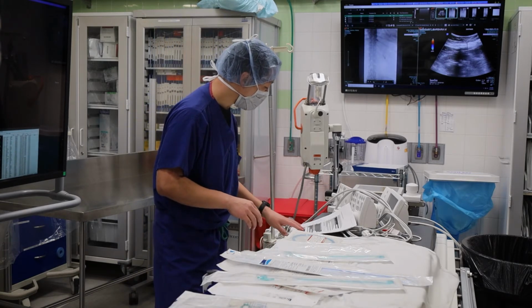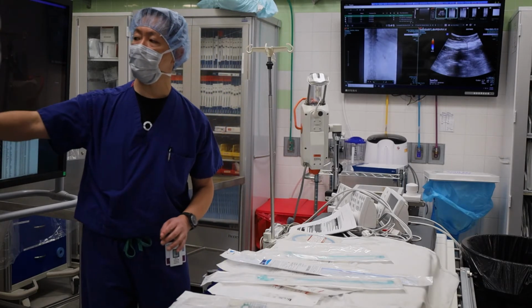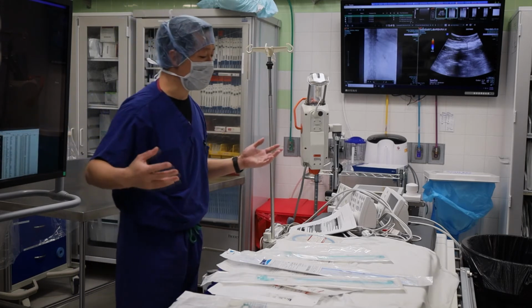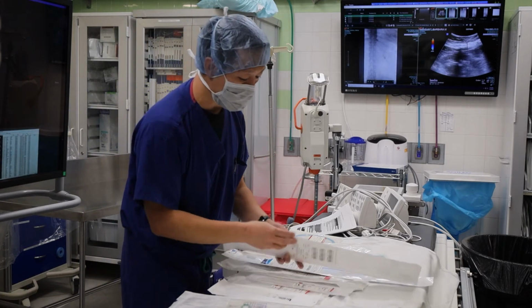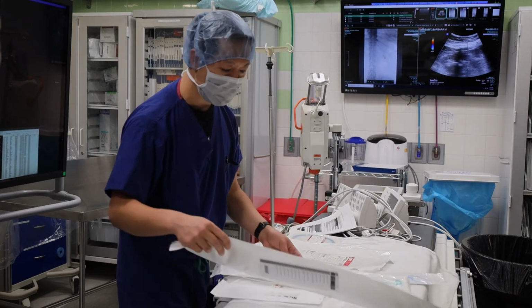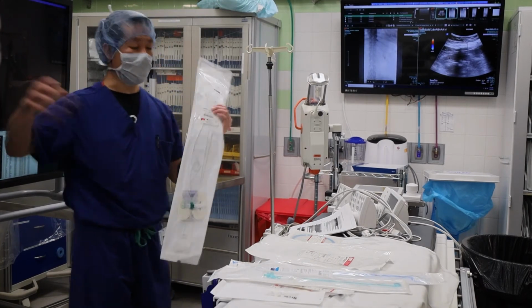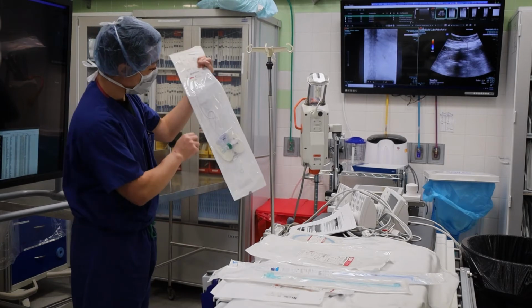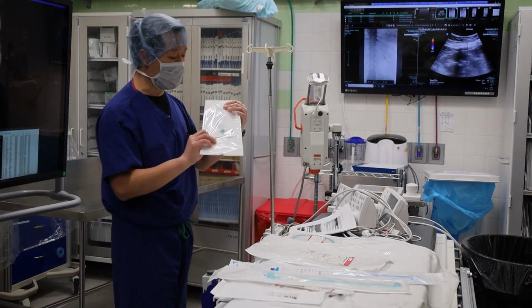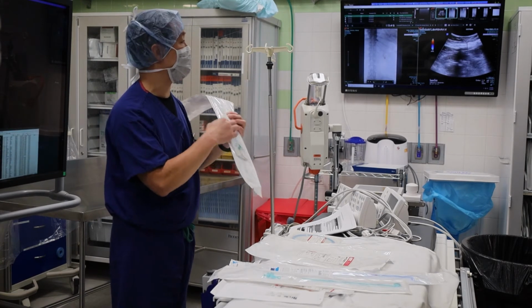Okay. All right. So imagine this patient has her perc Neph, and then they can't get out the stone. At some point, people don't like carrying around bags their whole life. And so that's when we go to a nephroureteral stent, okay? What a nephroureteral stent is, it's a perc Neph, at least the first part of it, to here. And then it goes all the way down to the bladder. I tell people this is kind of like a soaker hose that I buy at Home Depot. It's got holes throughout the whole thing.